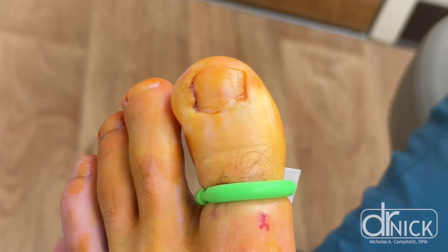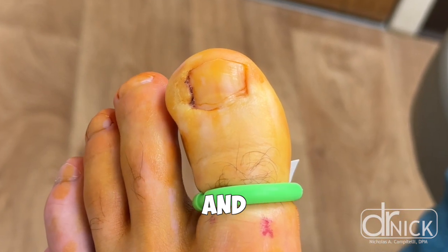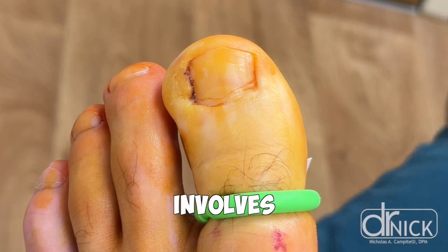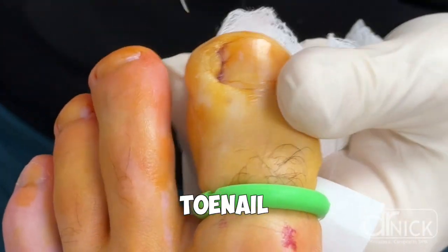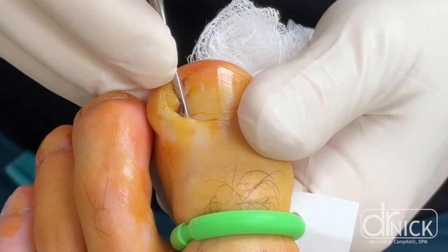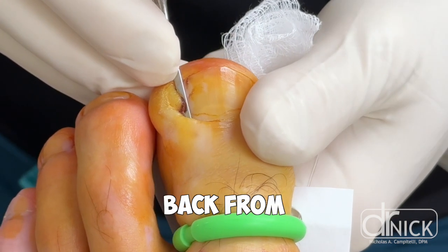In this particular example, we're demonstrating how we perform what's called a matrixectomy, and this is when we permanently remove the side of the toenail to prevent it from coming back. A matrixectomy involves removing about two to three millimeters of the side of the toenail, and then we introduce a chemical into the border of the nail fold under the eponychium, which is the cuticle area. This chemical creates a burn, which will stop the toenail from growing back from that side.